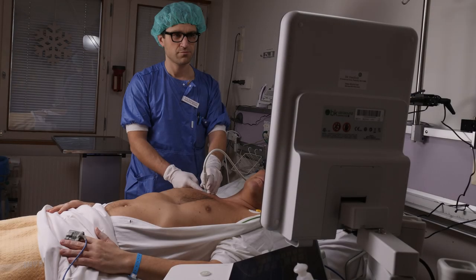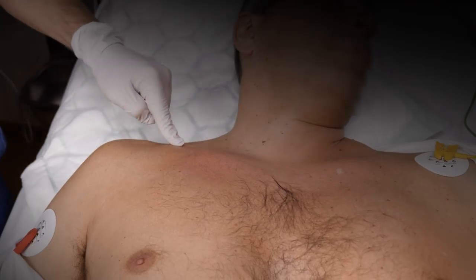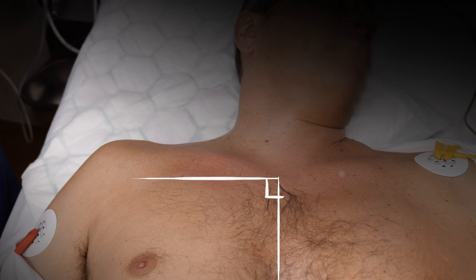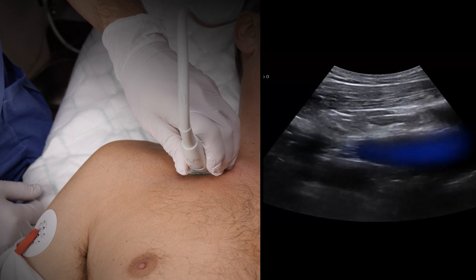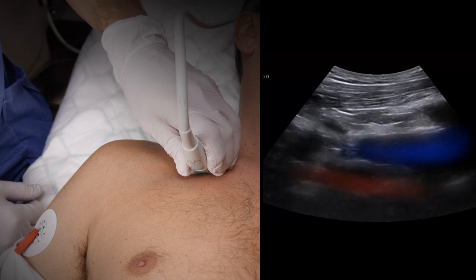Be sure to have a comfortable working position with the ultrasound machine clearly within your line of sight. Locate the vein by first identifying the clavicle, then visualize a line at a 90 degree angle from the body's midline and align the probe with it. Then tilt cranially in order to visualize the subclavian vein, artery, or preferably both vessels in the same view, here highlighted in blue and red respectively.